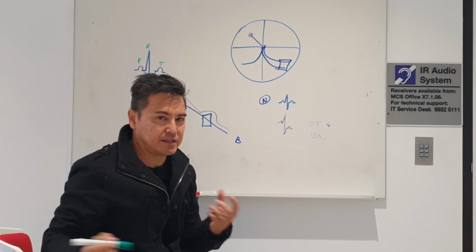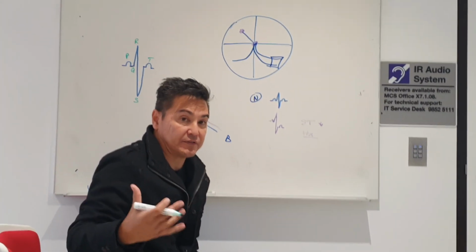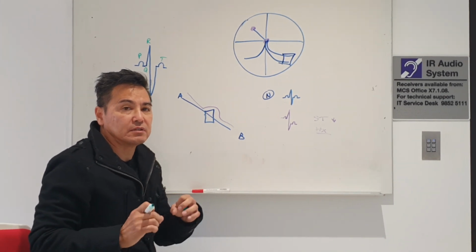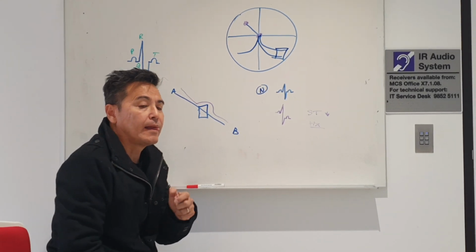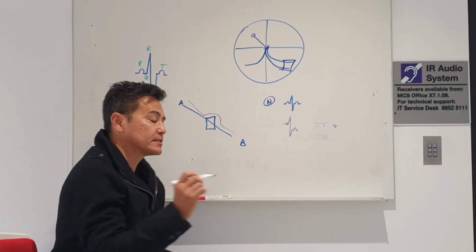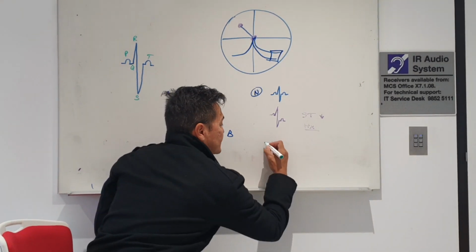Now this is where things get a little bit weird, and you have to believe me, all right? Because there's no scientific explanation as to why this happens. But let's say, for example, I took this heart muscle and I choked it for a while of oxygen, and it's not dead, but it's dying, okay? The tissue that's dying has an altered ability to pass electricity through it. We don't know why, but it does sort of this. And if we do a 12-lead ECG, right, we can actually see that, and it looks like this.